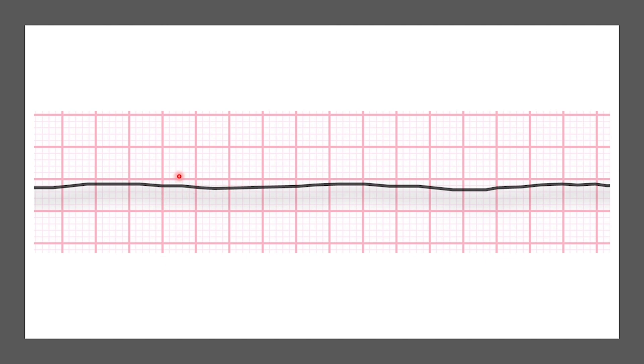So if we're looking at this rhythm together, we can remember our rules of interpretation. There's no obvious P wave, there's no QRS complex — it's almost like a flattened rhythm. This is a very easy one you see a lot in medical shows. This is asystole.